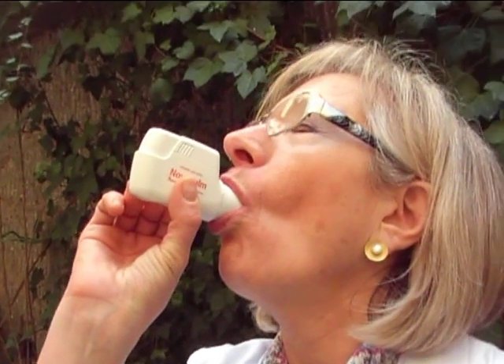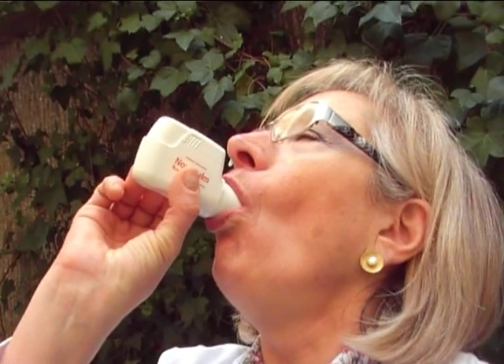Breathe out while turning your head away from the inhaler. Place the inhaler between your teeth and seal with your lips. Inhale deeply and fully, hold the air in your lungs for 10 seconds and breathe out slowly.